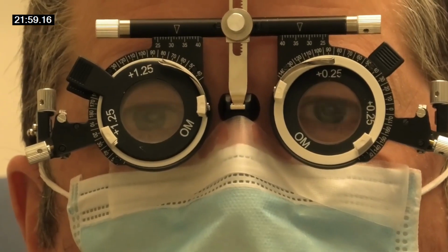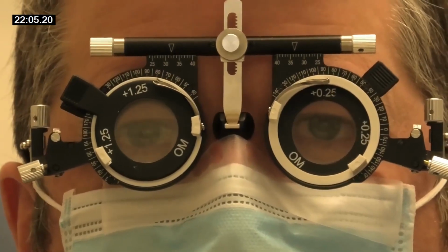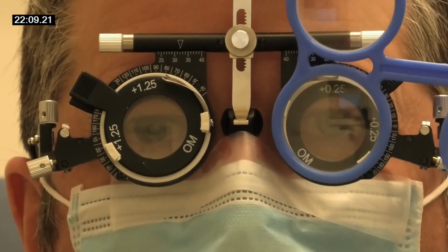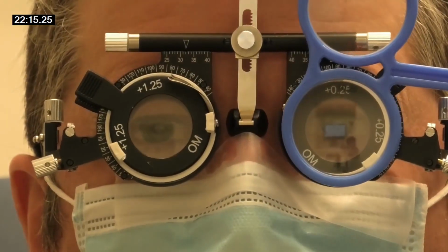What line can you see now? Still the bottom one, CROKS. Yeah, bottom one, yeah. And is that clearer with this lens? So is it better? Is it the same or is it worse? I suppose at this stage.